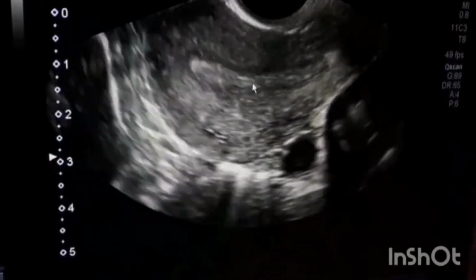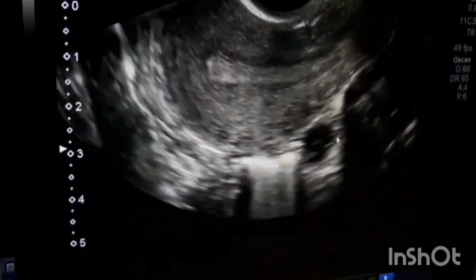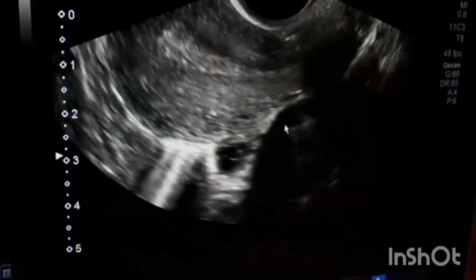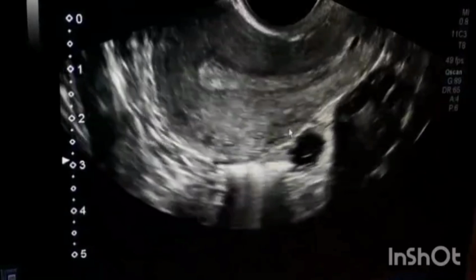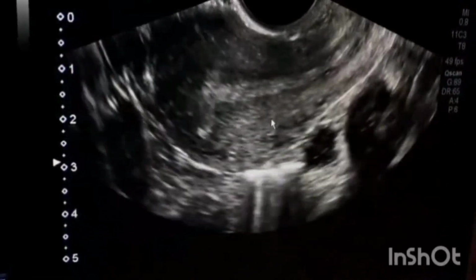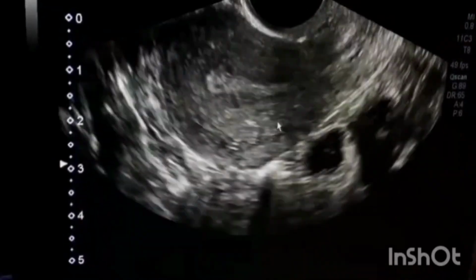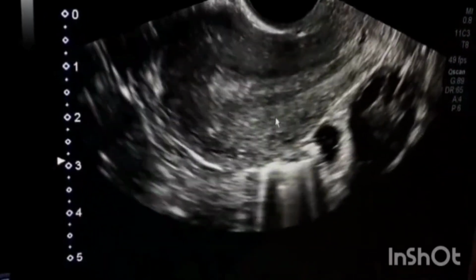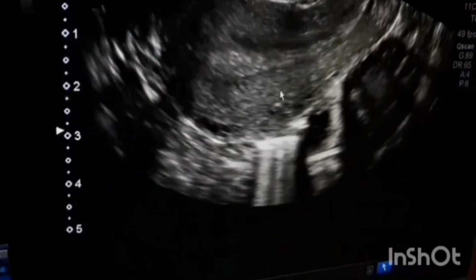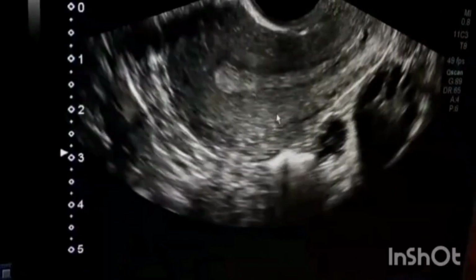And when we come to the ovary, we will easily find the number of follicles and thickened stroma. Still, this is myometrium in the uterus. Endometrium is echogenic. Myometrium is clear.